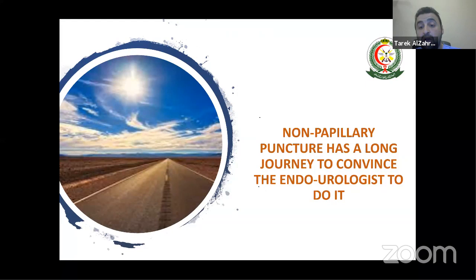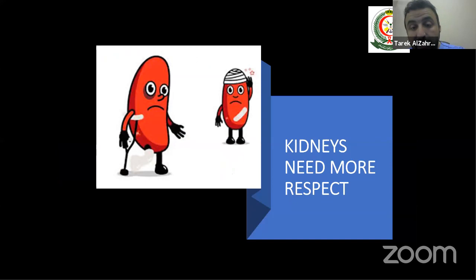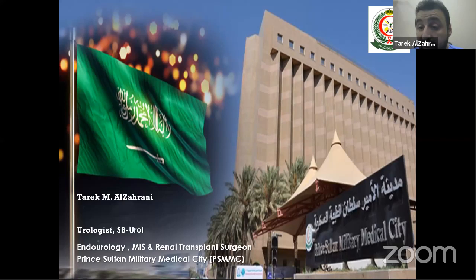Thank you very much. And I personally have a few questions. I'm sure I've done a non-papillary unintentionally, not intentionally. I wouldn't intentionally do a non-papillary, but probably not okay with it. But again, for those who do PCNLs, probably the only thing that might draw you from a PCNL to a URS is the fear of this bleeding.